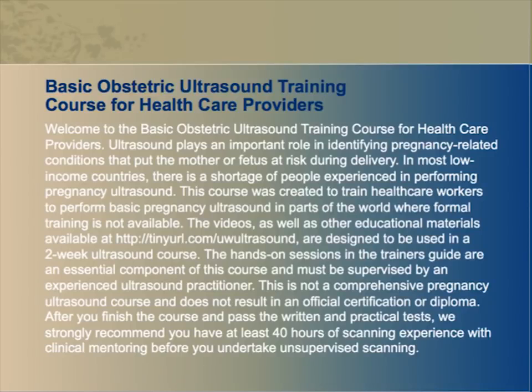Ultrasound plays an important role in identifying pregnancy-related conditions that put the mother or fetus at risk during delivery. In most low-income countries, there is a shortage of people experienced in performing pregnancy ultrasound. This course was created to train healthcare workers to perform basic pregnancy ultrasound in parts of the world where formal training is not available. The videos, as well as other educational materials available at tinyurl.com/UW-ultrasound, are designed to be used in a 2-week ultrasound course.